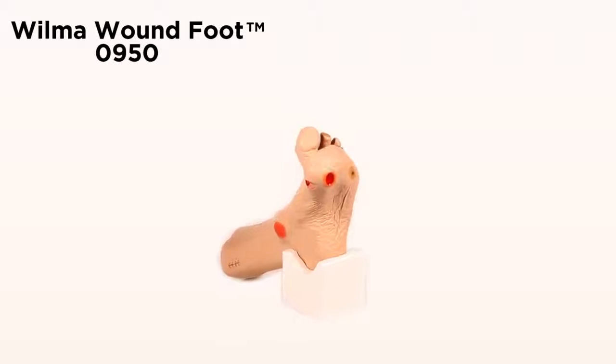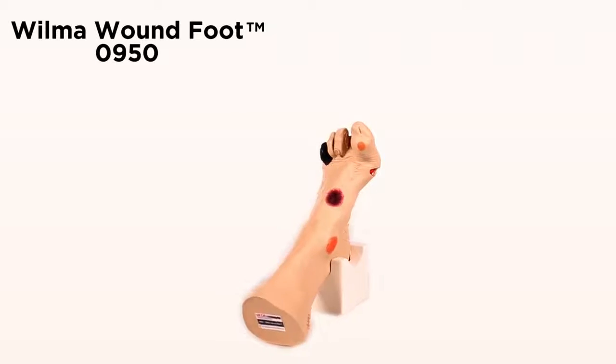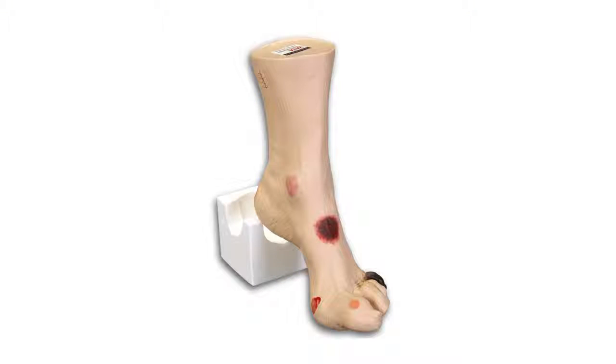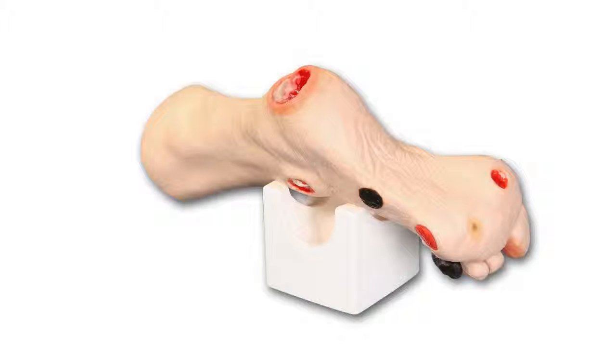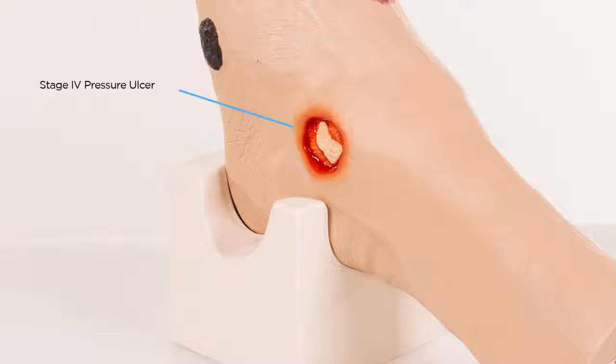Wilma Wound Foot Model 0950. Wilma Wound Foot displays 20 different conditions. For pressure ulcers, there is a Stage 1 on the medial malleolus, Stage 2 on the lateral part of the foot, Stage 3 on the heel, and a Stage 4 over the lateral malleolus displaying bone with osteomyelitis and tendon.